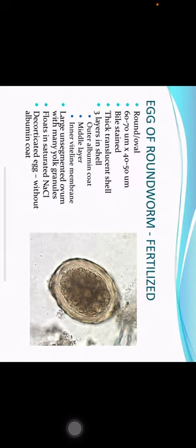Eggs and larvae in stool sample. Fertilized egg of roundworm: it is round to oval in shape, 60 to 70 micrometers by 40 to 50 micrometers in dimension. It is bile stained. The fertilized egg of roundworm has a thick translucent shell with three layers: outer albumin coat, middle layer, and inner vitelline membrane. Inside there is a large unsegmented ovum with many yolk granules. The fertilized egg of roundworm floats in saturated solution of common salt.